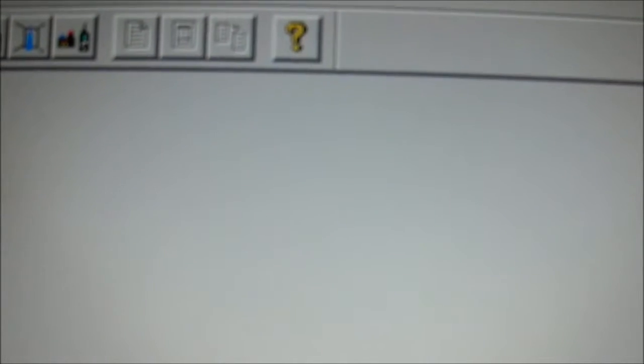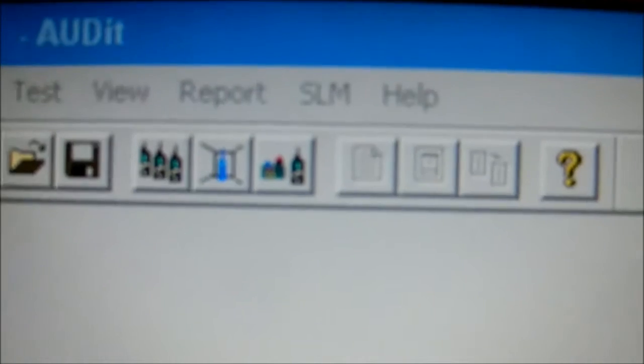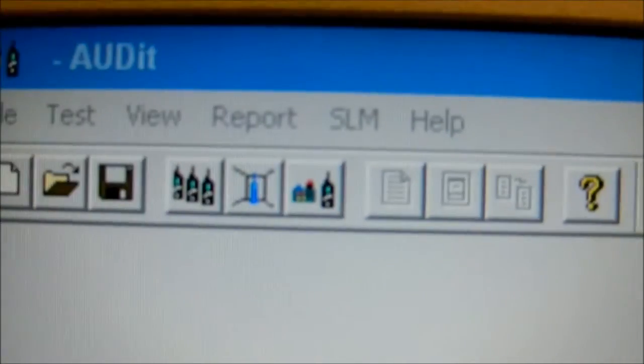Checking the sound meter calibration. Here in the audit software we will select SLM for sound level meter.